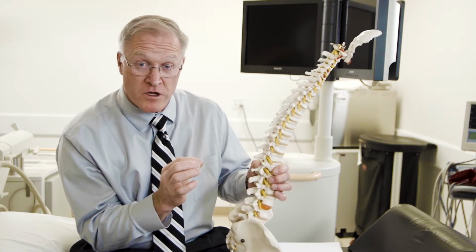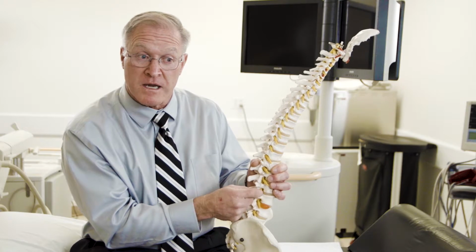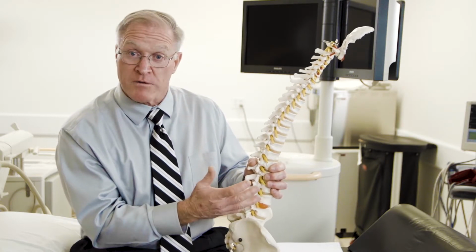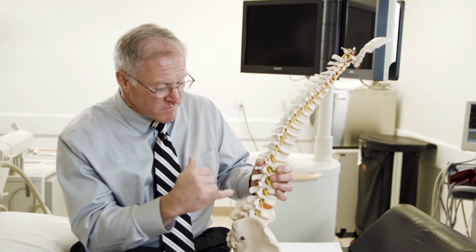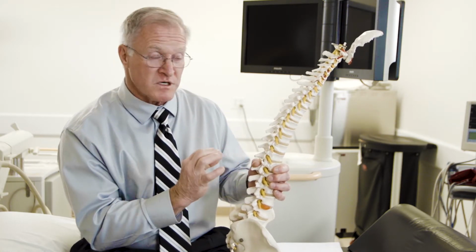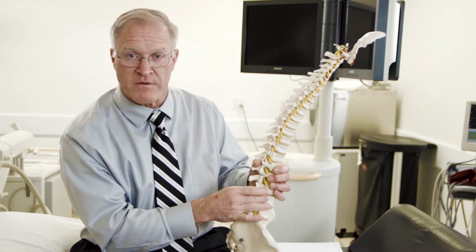Now, for a selective nerve root block, we're then going to use a very small volume of local anesthetic and steroid and numb one root and then add a small amount of steroid. For the transforaminal, just like with any other epidural, once we've entered the foramen enough that we can see the contrast entering the epidural space, typically a slightly larger volume will be utilized because we're not specifically picking out one root, but simply trying to treat a general area around that root.